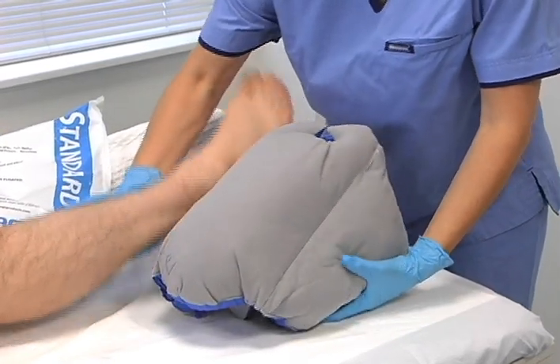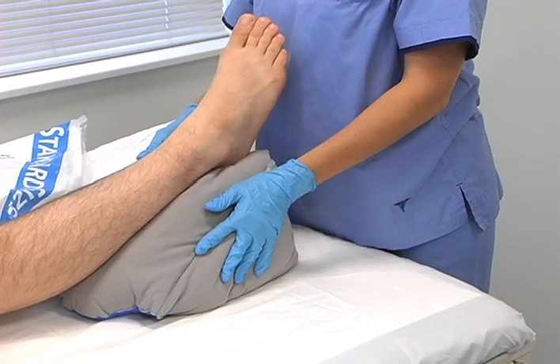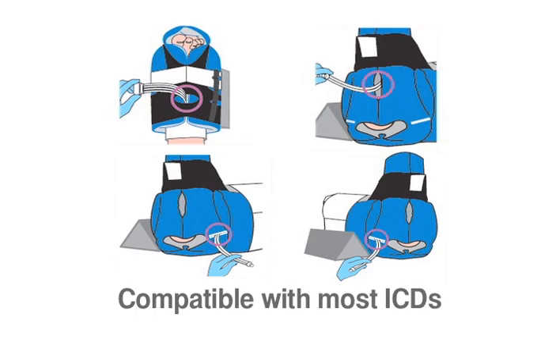Place Prevalon on the bed with the long side next to your patient's leg. Position the heel over the opening. This is essential to float or offload the heel. Prevalon Standard has four intermittent compression device access ports.